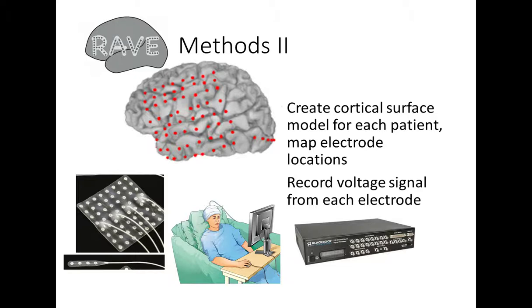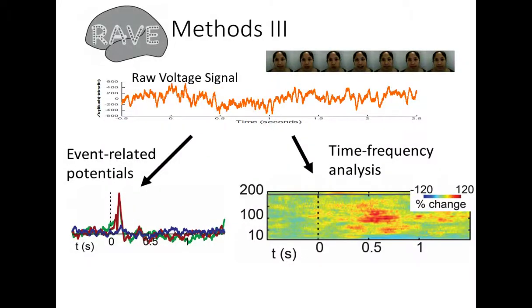So you can see the wire coming from the top of the bandage in the middle cartoon and fed into a BlackRock system where the data is recorded to a computer hard disk. After we collect the data, we can feed it into RAVE and do many different kinds of analysis. Just to give you an idea of the kind of analysis, 2 kinds of analysis.